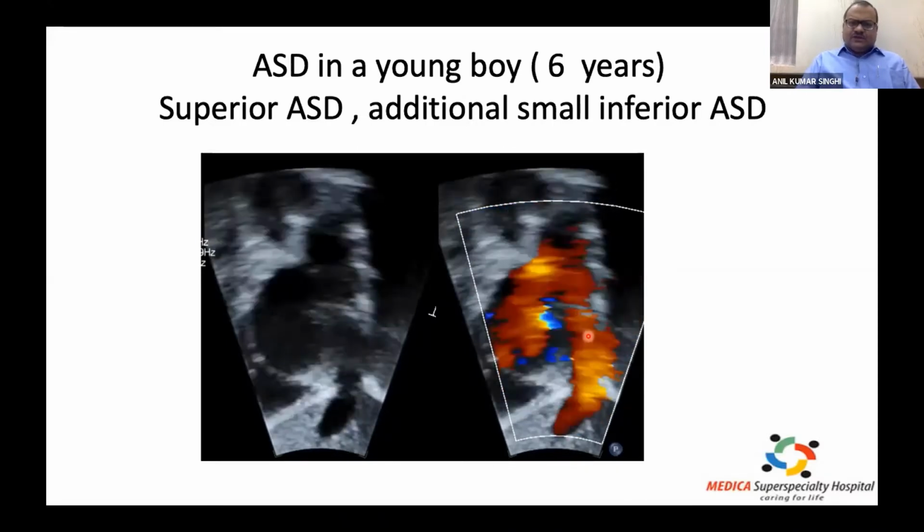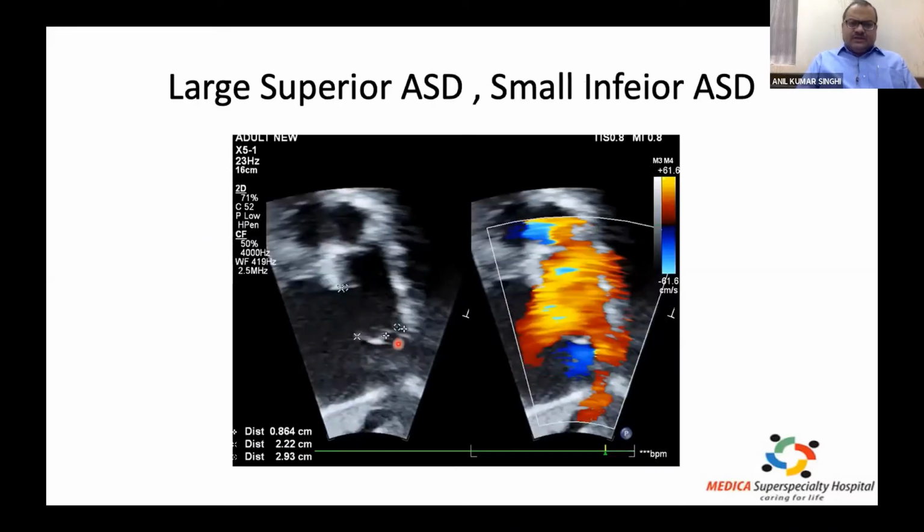So this is a frozen image of the same. The superior hole measured approximately 22 millimeter, the smaller one 8 to 10 millimeter, and total length. So this actually, the ASD runs from this inferior margin to that margin. It's frequently difficult to exactly decide on the size of the ASD based on the floppy margin, because we will be banking more on the solid margin.